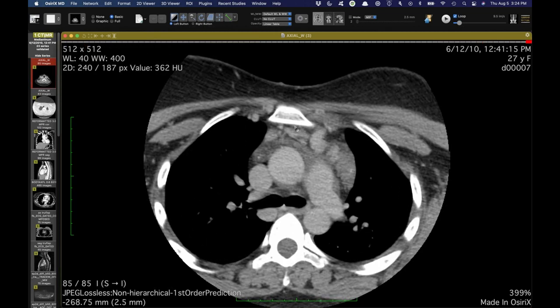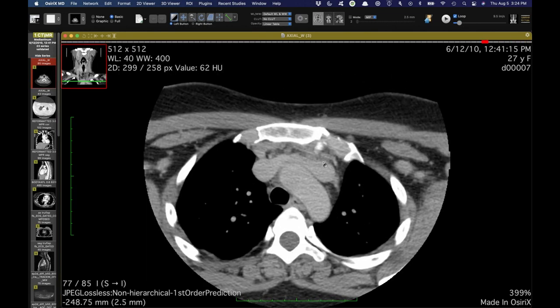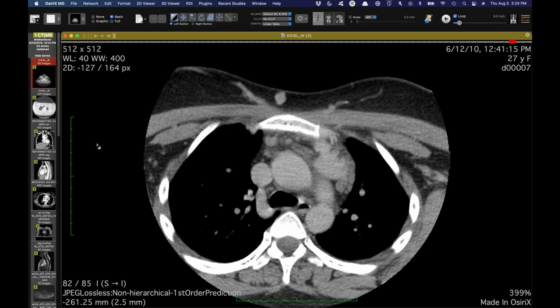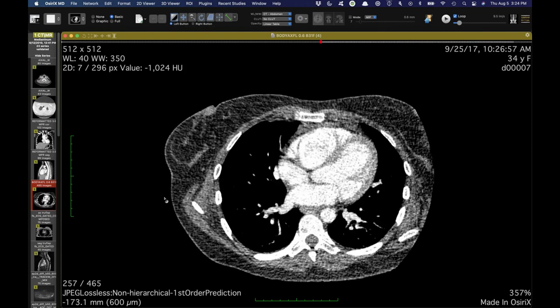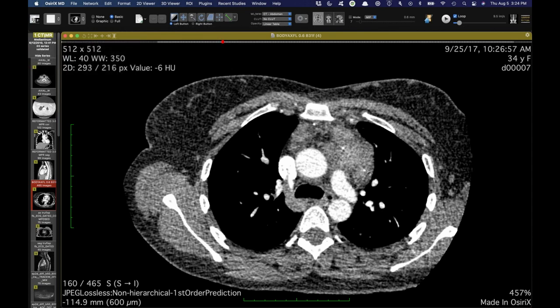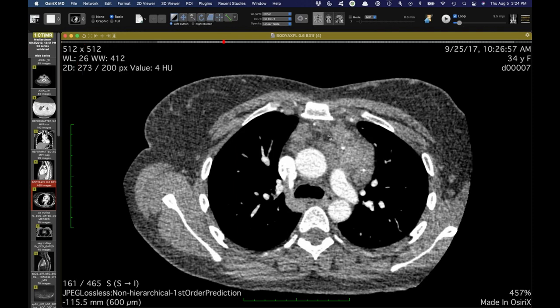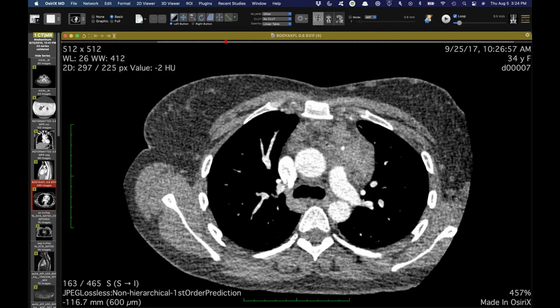But it was noticed that this patient had some weird stuff in their anterior mediastinum, and you can see that they have a fairly dilated brachiocephalic vein and a weird vascular structure here. And that was on a neck CT, so of course that prompted further chest imaging. I've only pulled up representative images, but this is one from a few years ago now, and it's been mostly MR, which I'll show you in a moment. But we see this anterior mediastinal thing or lesion, for lack of a better term. And there's a lot of fat and soft tissue interspersed here. There are some little punctate areas of calcification.